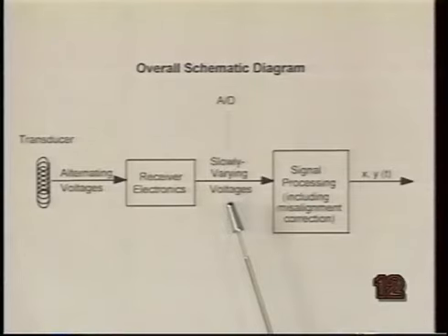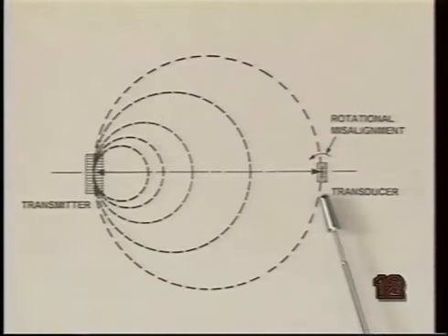We can also digitize simultaneously the output of other transducers. The digitized signals are converted by signal processing software to X and Y coordinates in the midline plane. As the articulators move, the transducer axes can vary in their alignment with the transmitter axes, causing potential measurement error.